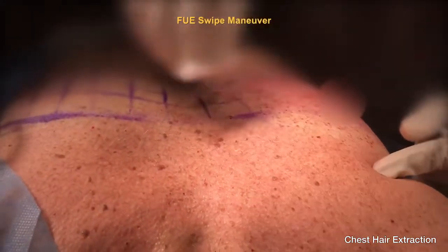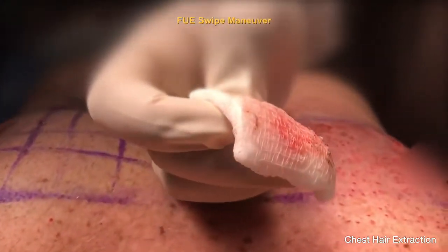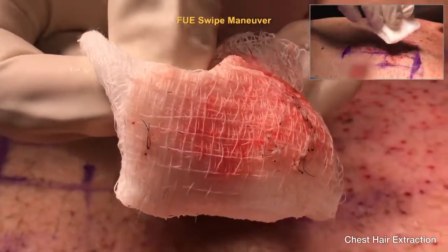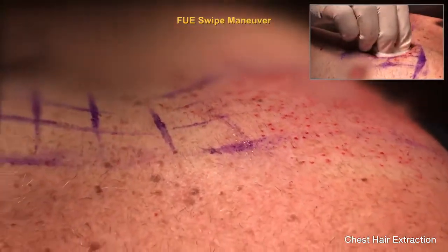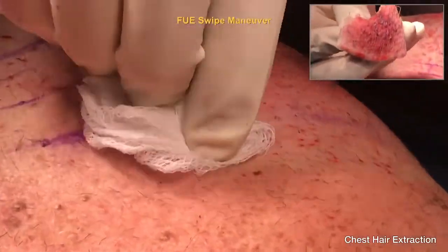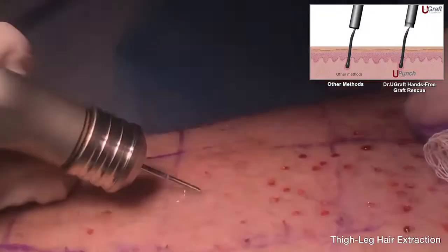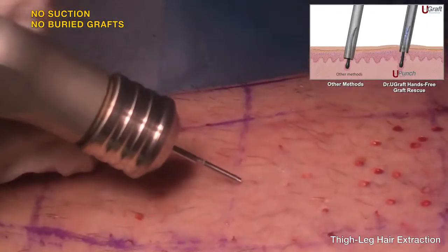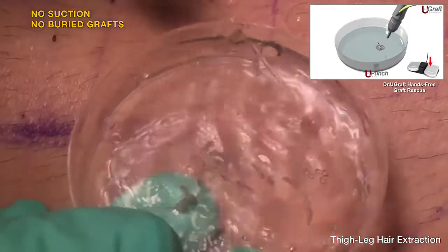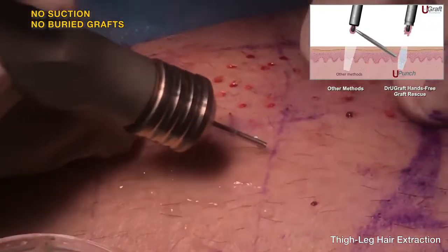This is the FUE swipe maneuver. It can be swiped back and forth. There are no transections, even when dealing with tough angulation like this hair. In this case, there are no transections at all.